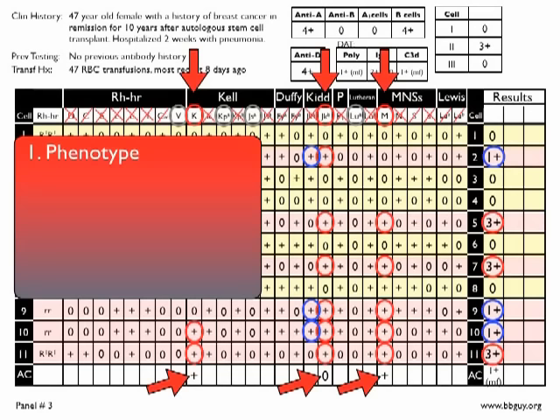The select cells are primarily where you're going to make a big difference in this case. You're going to do some things like get a cell that's big K positive, JKB negative, and M negative. Make sure there's no reaction with that cell to rule out big K. Or a cell that's big K negative, JKB negative, and M positive. Make sure that that's negative to rule out anti-M as a target of your antibody.